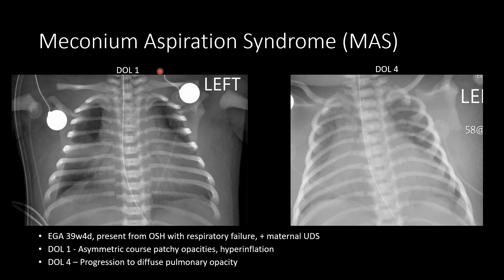Here we have a day-of-life-one case with severe respiratory distress, presented from an outside hospital with respiratory failure, and a positive maternal drug screen. We see coarse asymmetric patchy opacities and pretty large lung volumes on the left side. By day of life four, there is very rapid progression to diffuse opacification of the lung, and this patient did not survive.